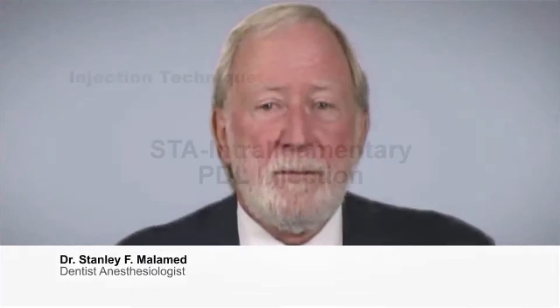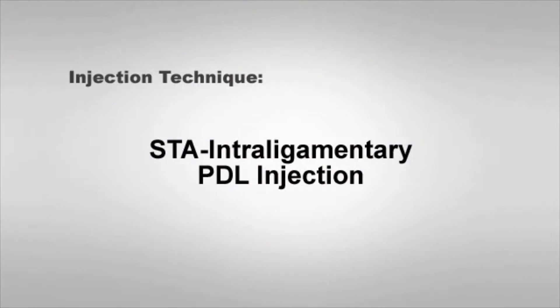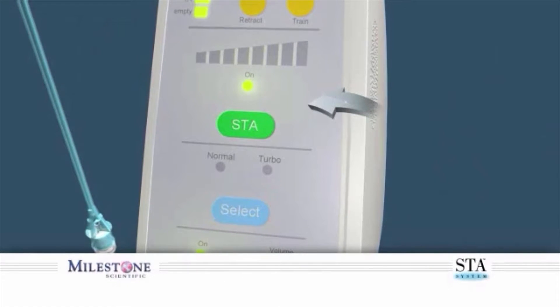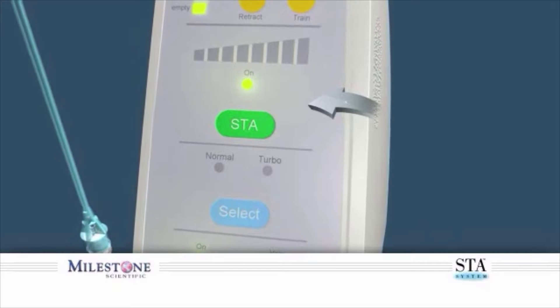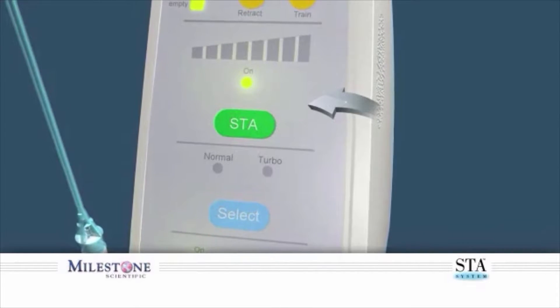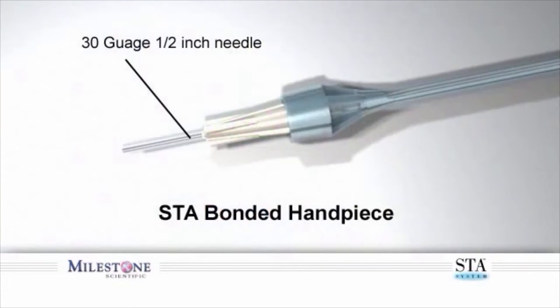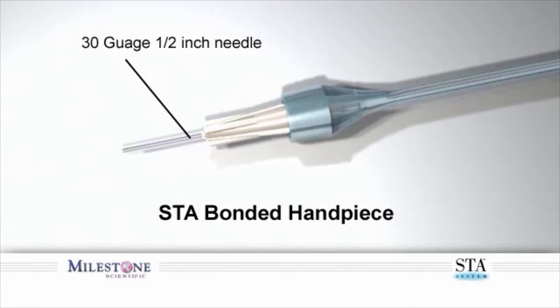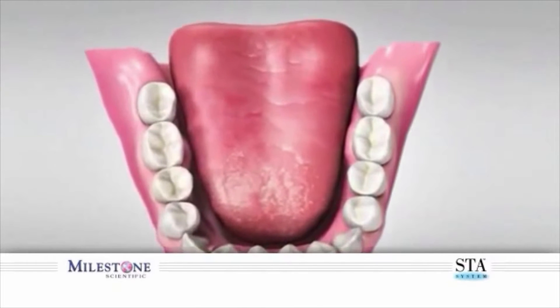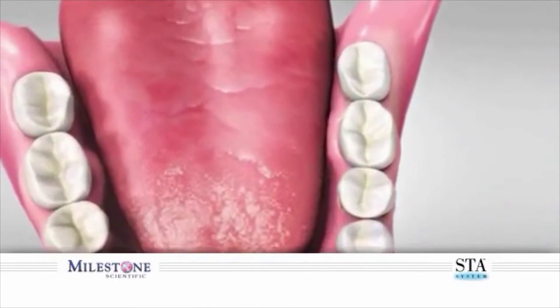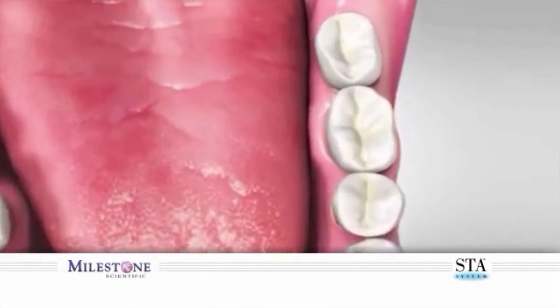Injection technique: The Wand STA intraligamentary PDL injection. Verify the wand system is set to the STA mode. This injection is performed using the 30-gauge 1/2-inch bonded wand handpiece. When performing the Wand STA intraligamentary injection on a multi-rooted mandibular molar, it is recommended that two sites be used.